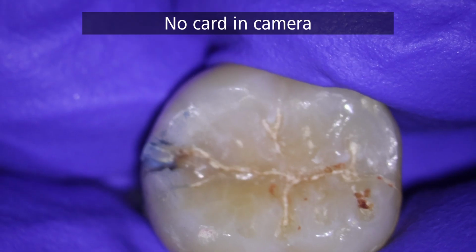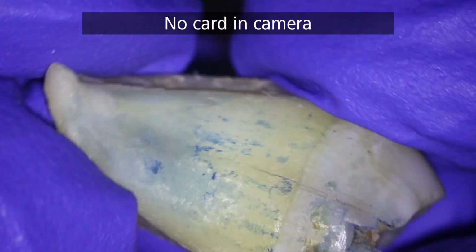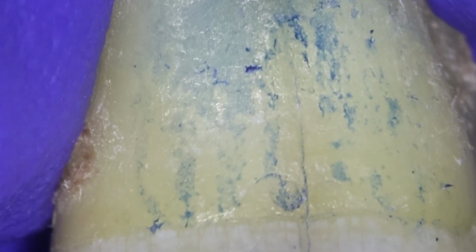So that's an occlusal view of the tooth. Here you can see the vertical fracture of the root. We stained it so that it would show up a little better, and then we're going to actually take a disc and section the root into two parts.